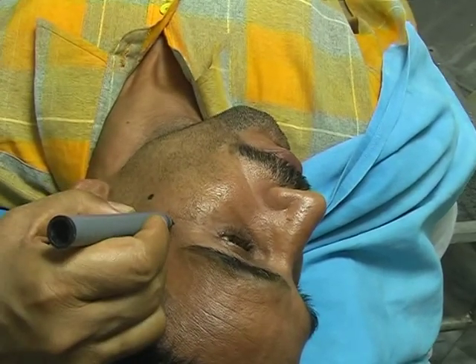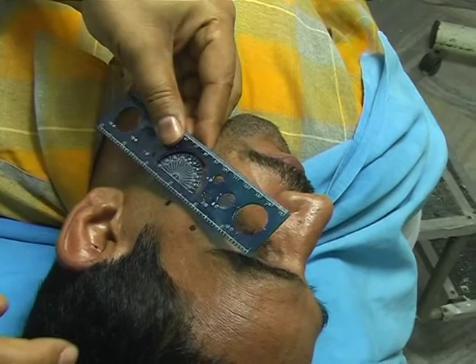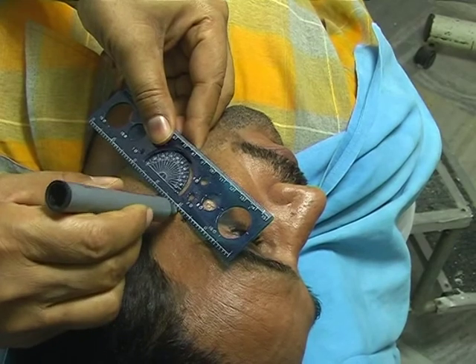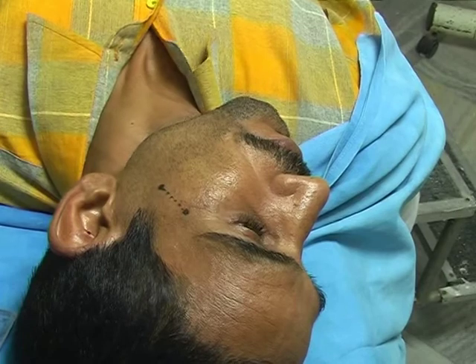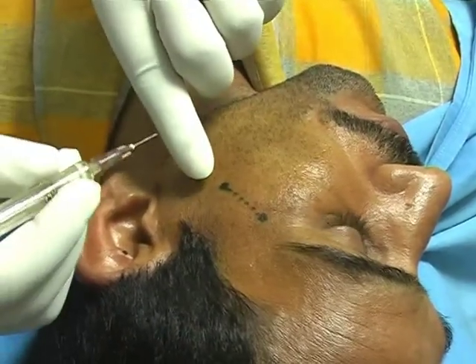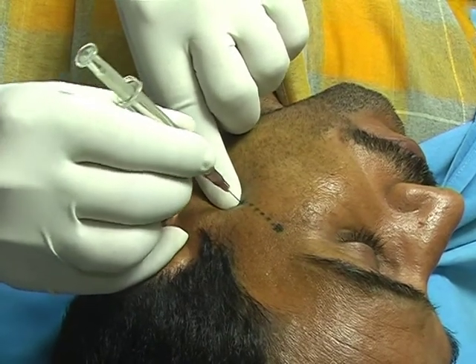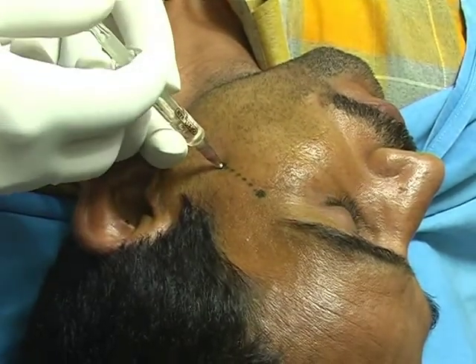So the other mark, as I have already told you — join these two lines. This will be the direction of the needle, and needle angulation is about 60 degrees with a fine-gauge needle. This angle will be the direction of the needle going anteriorly. Always aspirate before injecting.